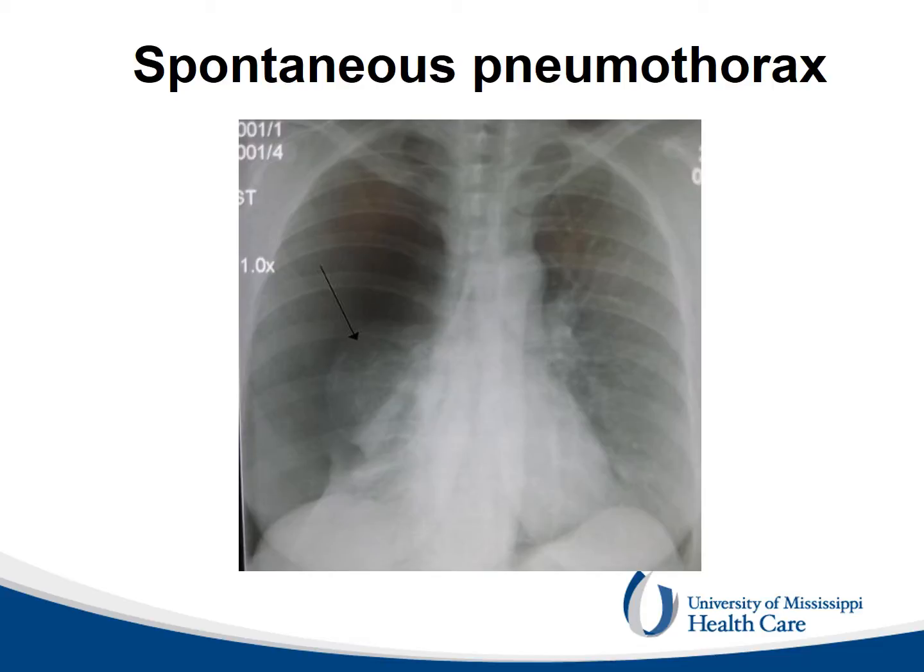This chest X-ray demonstrates the presence of a large right pneumothorax with lung collapse and minimal mediastinal shift toward the left.